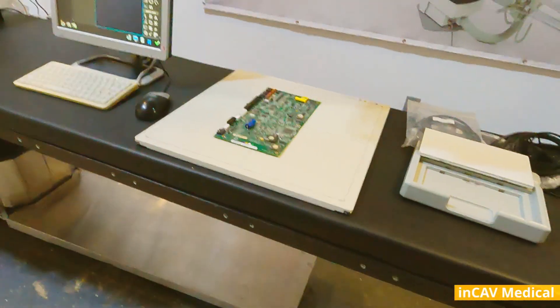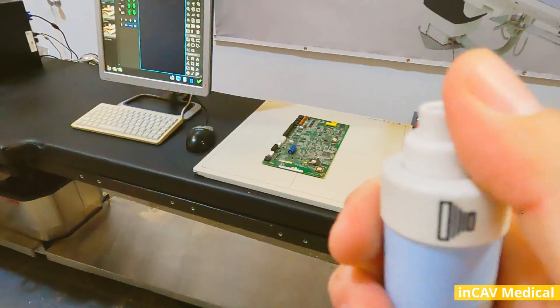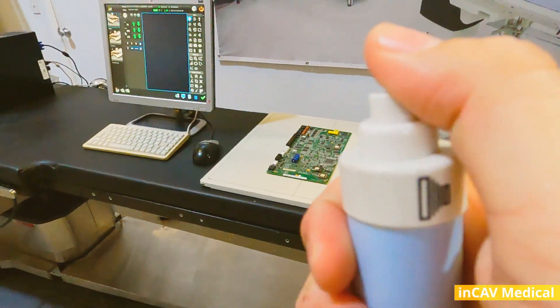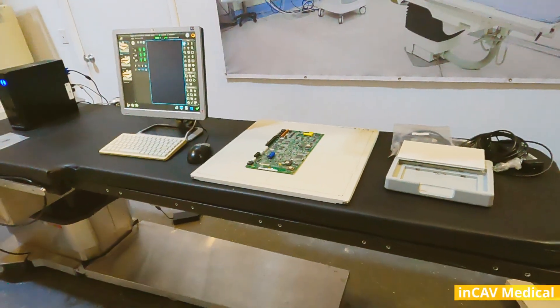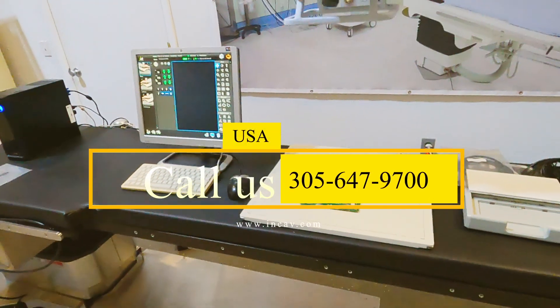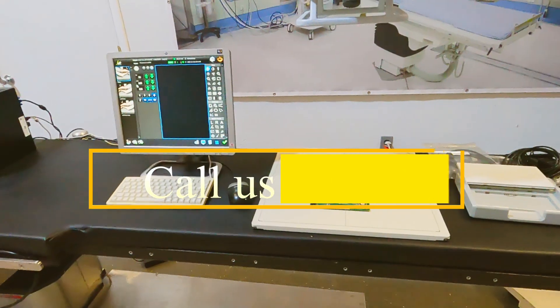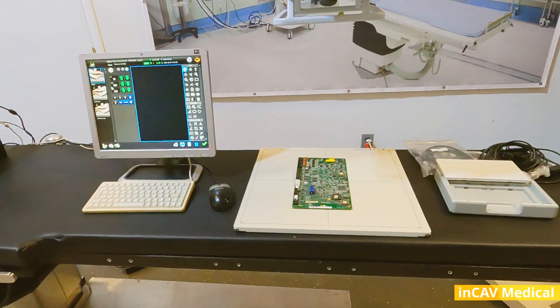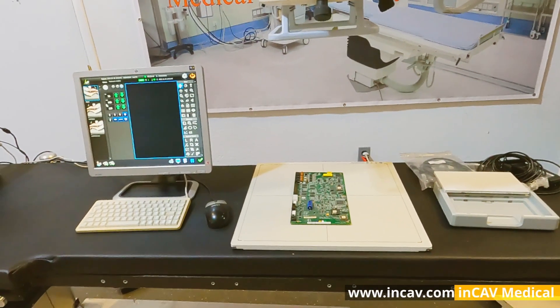Now we are ready to take our first exposure. We are going to be behind the x-ray shield for protection. Remember, protection is the first rule when you are shooting x-rays. Radiation is not a game.